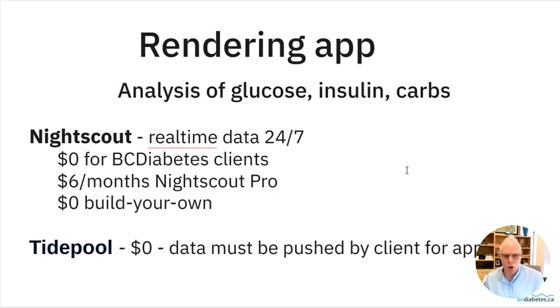Tidepool is an excellent option for people who don't have Night Scout. Your clinic gets a Tidepool code, and the patient sets up a Tidepool account and shares their data with your clinic code. They need to push the data to Tidepool before every appointment.